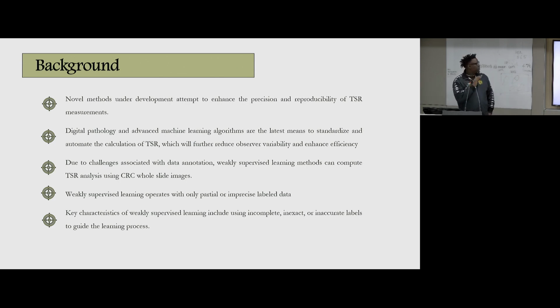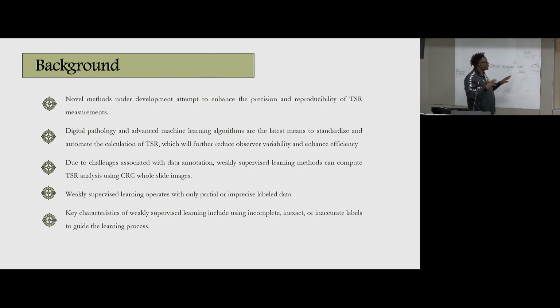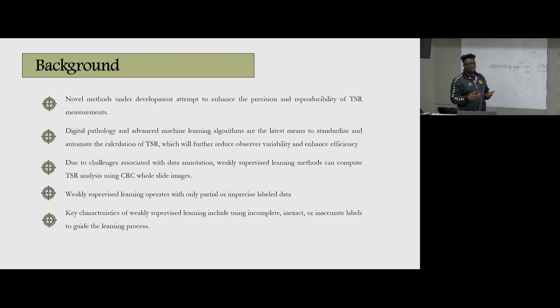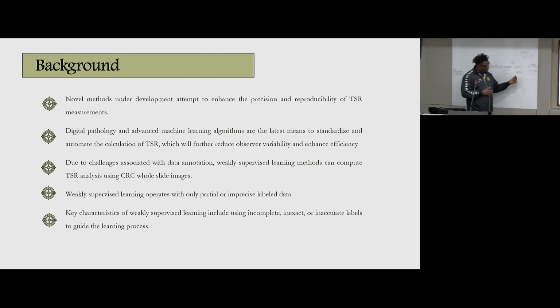Now, supervised learning techniques don't work in this case for one reason: the slide is so big. And in weakly supervised learning, we must use the slide level label because it's important. But labeling is then a problem, so we need to understand it. As I said before, the pathologists annotate just a region of interest, and we use it as the whole slide level label, but it didn't show good performance. I will demonstrate it now.